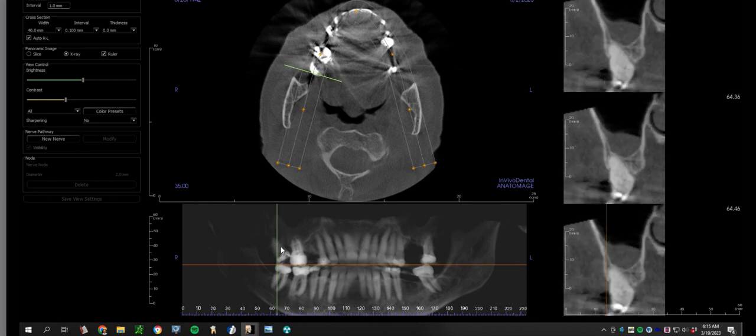This tooth looks compromised, so I'm not surprised that if there's infection inside of this tooth, the Schneiderian membrane, which is a biologically active entity, would inflame in response to the presence of that infection. Which is why sometimes when we have sinus allergies, we get thickening here. We have patients who have increased nerve sensation, pain, dysesthesia, or what have you, associated with adjacent teeth.